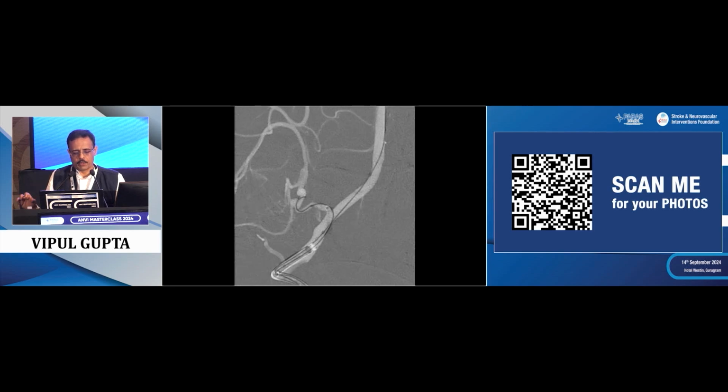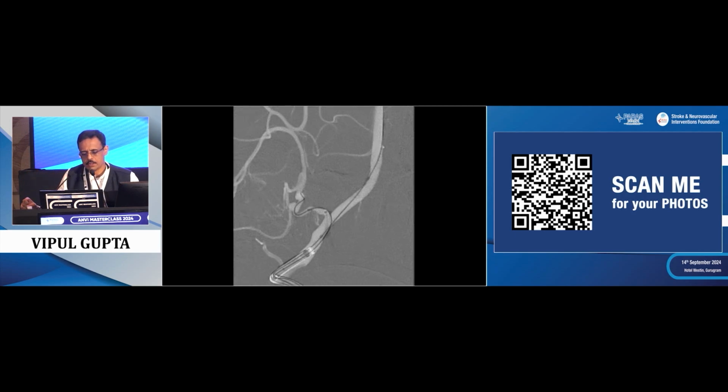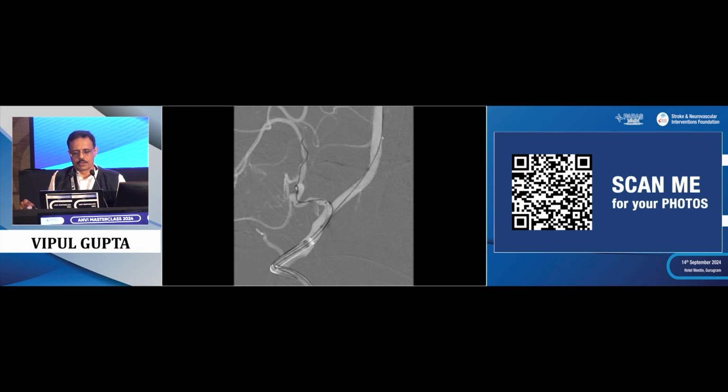And in the other plane, it was very useful to see that the wire is going around. You give it a torque, slight pressure, give it a torque, and slowly it may travel distally. So this was a lot of trouble, many wires wasted before we really managed to do it. You can see how crumpled the wire is because we get a very, very tight pigtail, as tight a loop as we could, and that only helped us to cross the lesion.